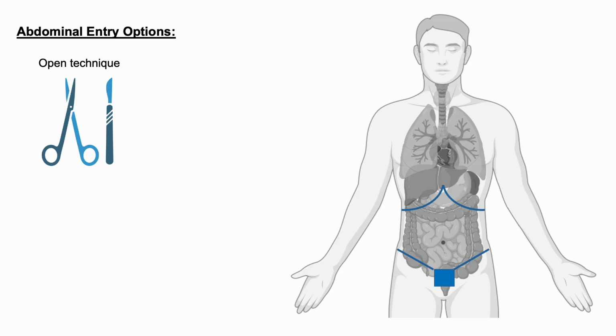the Pfannenstiel incision. The reason I prefer this over, let's say, a periumbilical Hassan entry is because the periumbilical port site has limited utility for the remainder of the operation. The hernia rate generally tends to be higher. Pfannenstiel is more cosmetically pleasing. It can be a larger incision, so you can place a gel point and have multiple ports go into it, and the hernia rate is lower.